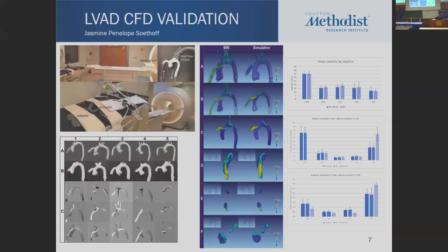Then just a little bit off here, this has nothing to do with endovascular treatment planning, but we did a small validation study where we used 3D printing, another one of those techniques, combining that with a clinical question, where we put those in the scanner. We had an explanted left ventricular assist device connected with hoses, shown in the setup on the upper left.